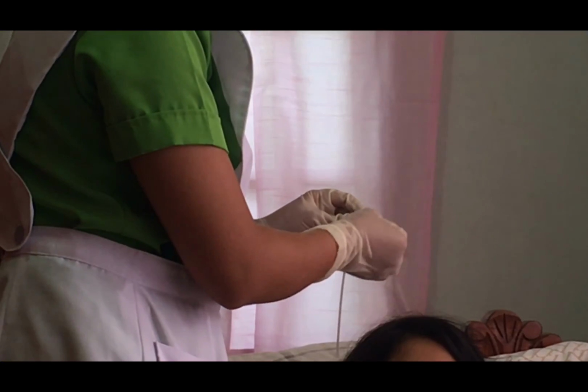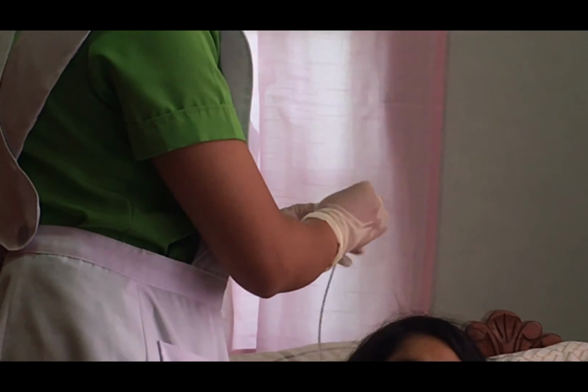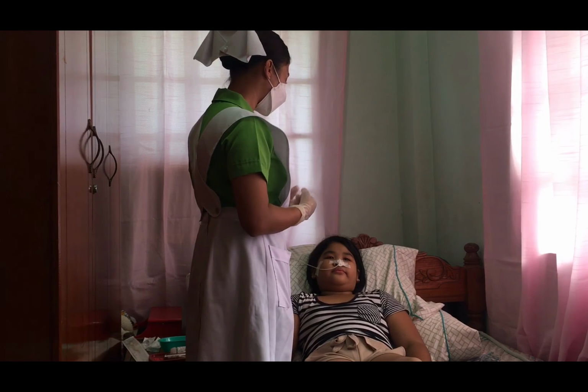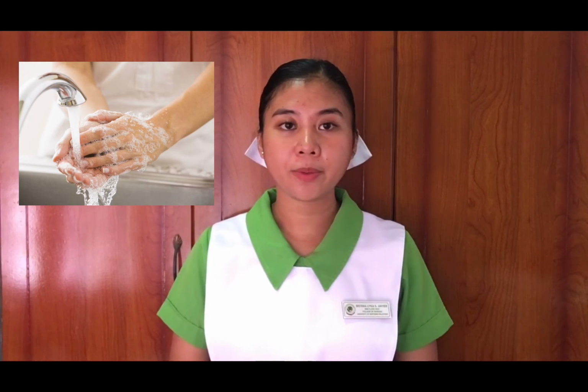After the oral formula feeding, close the feeding port with the stopper. Tell the patient that the feeding is done and thank her for her cooperation. Ma'am, we are done already with the feeding. Thank you for your cooperation. Discard all the soiled materials. Perform hand washing.